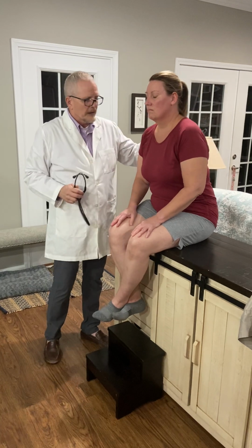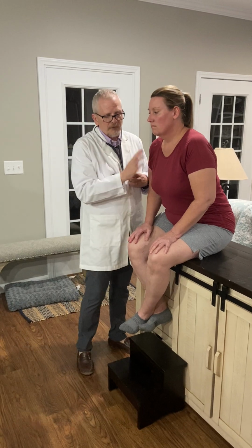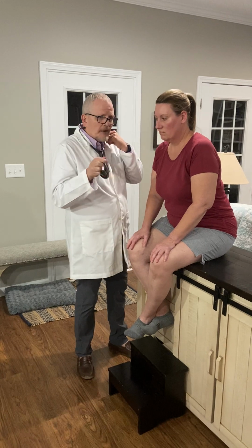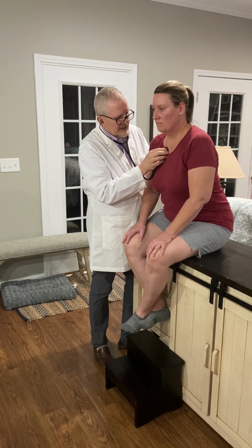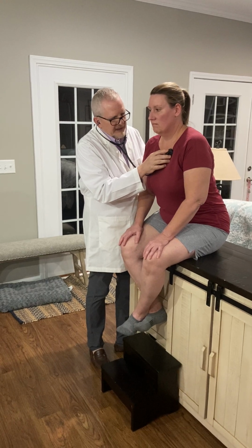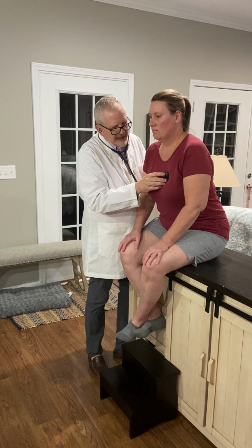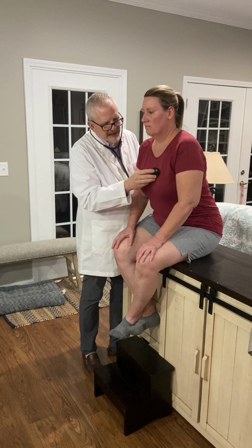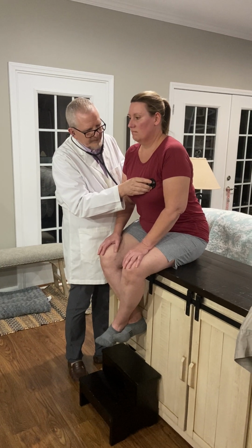Chest. If you just lean forward, I'm going to assess her heart now. There's 4 areas I'm going to assess. Normally I would assess twice, once with a bell, but I do not have a bell, so I'll be using my diaphragm only. First area is the aortic area, which is at the 2nd intercostal space, right sternal border. Then the pulmonic area, which is the 2nd intercostal space, left sternal border. Down to the tricuspid area, which is the 4th intercostal space, left sternal border. And then the mitral area, which is the 5th intercostal space, midclavicular area.